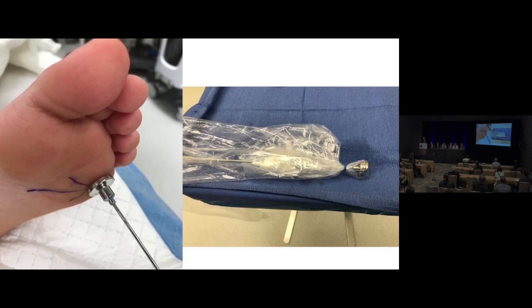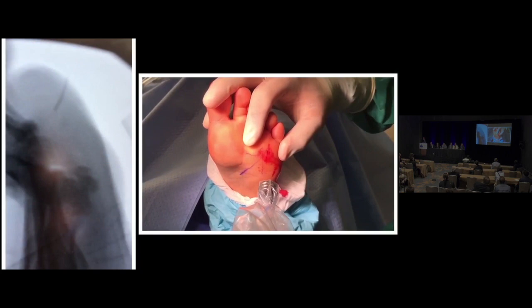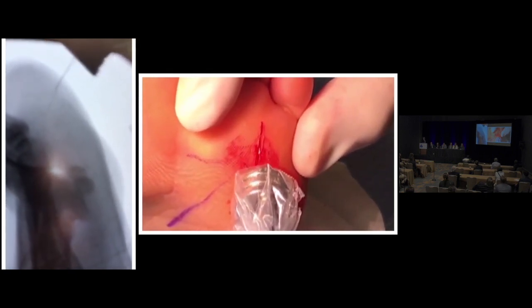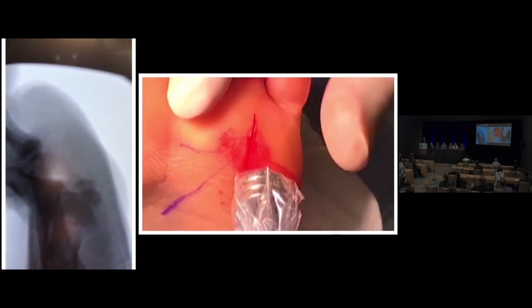We then place the magnet in a sterile US probe cover and prep the child's foot in normal sterile fashion. Utilizing fluoroscopy, we make a small incision over the area of the foreign body and into the dermal soft tissues. We then place the magnet in close proximity to the foreign body using fluoroscopy. The pin is immediately extracted from the soft tissues, as you see in this video clip, without the need for soft tissue dissection.